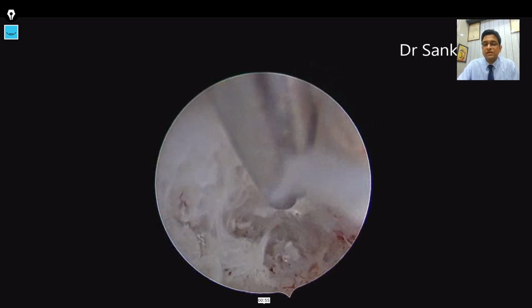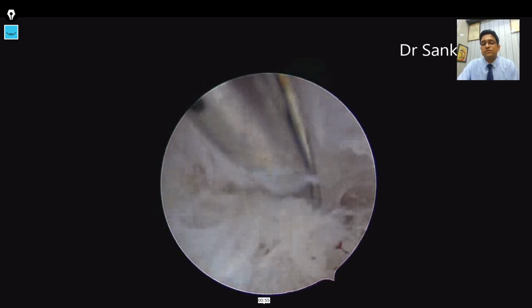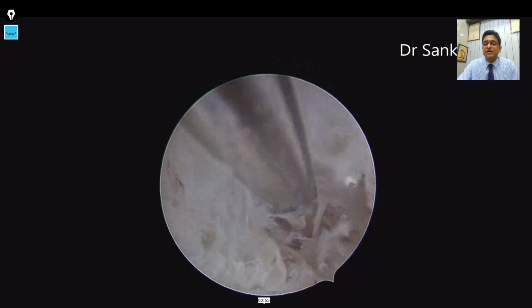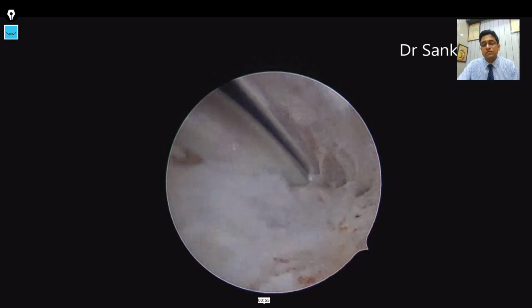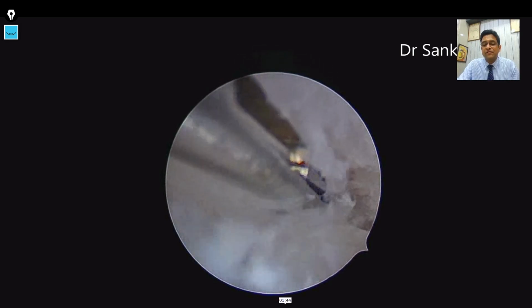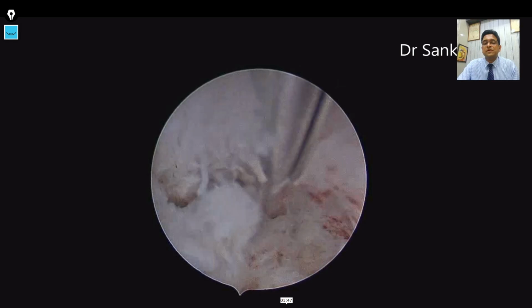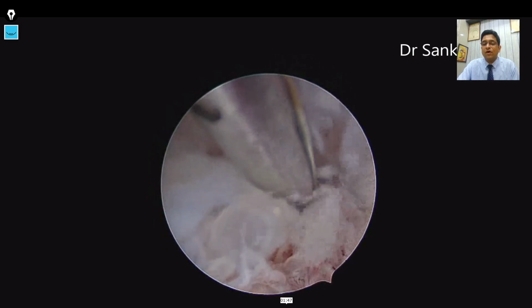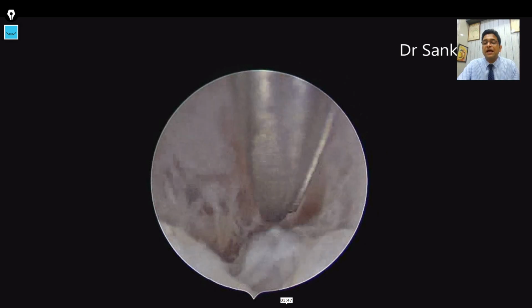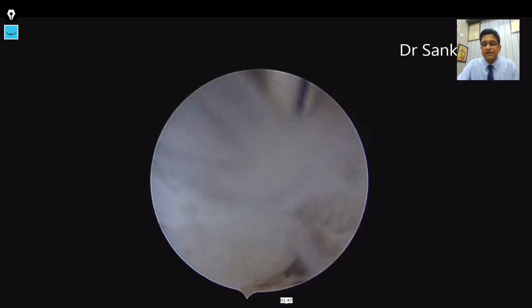This has to be a slow process because if this dilatation is done wrongly and the starting angle of inclination of the scissors is wrong, then one can easily perforate the uterine cavity, particularly in a small postmenopausal uterus. Once these short bursts of tunneling have been done and we are convinced about where the canal actually is, one can follow the principles of hysteroscopy to align the notch with the opening on the cervix, and then one is able to enter the uterine cavity because the distension slowly distends the internal os and allows the entry of the hysteroscope inside.